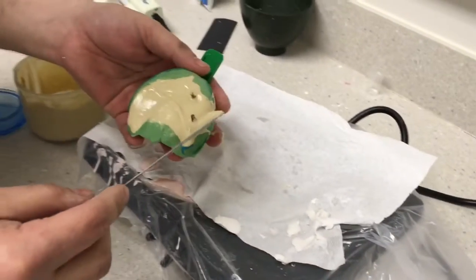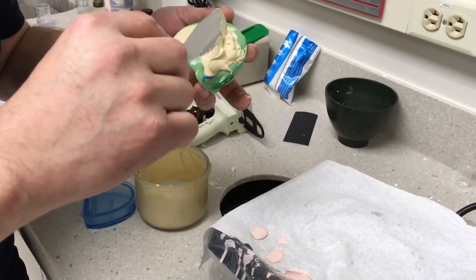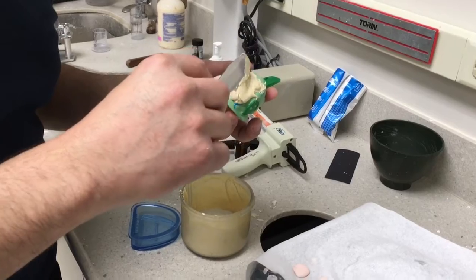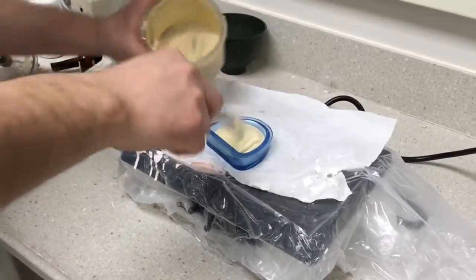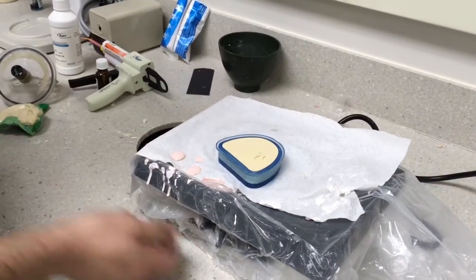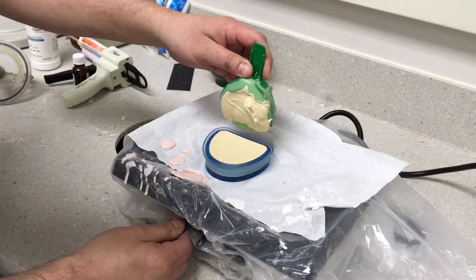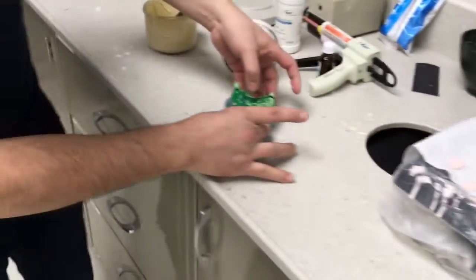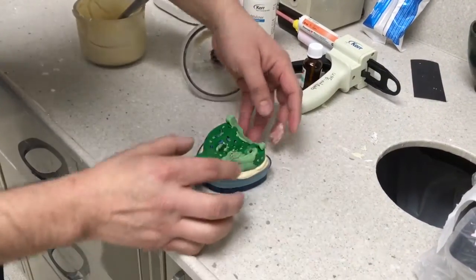We're also going to cover these analogs nicely — they have undercuts that you want to make sure are engaged. We're going to force them in. No vibration needed now — we're just going to squish it right into place.